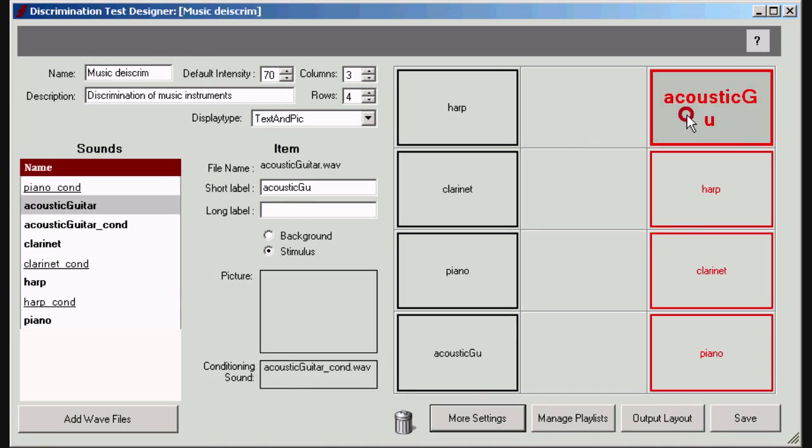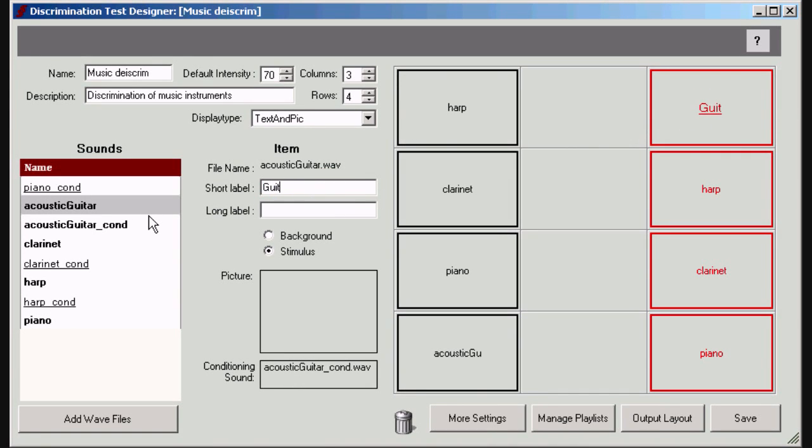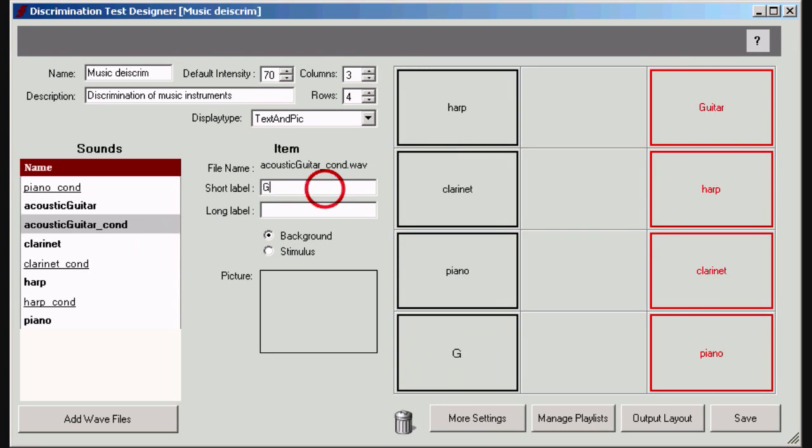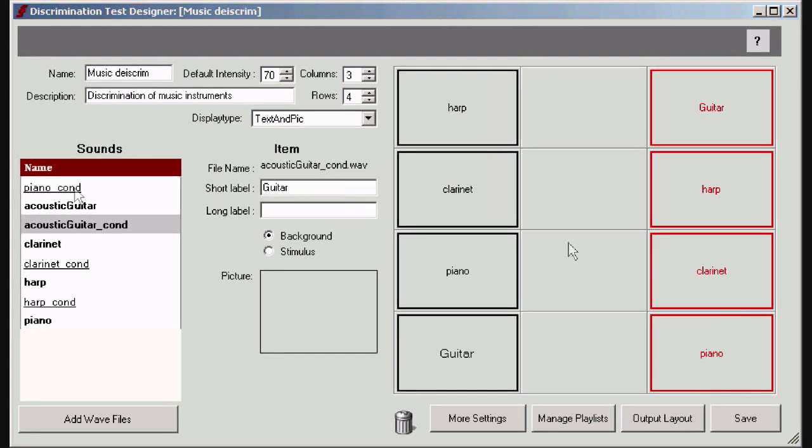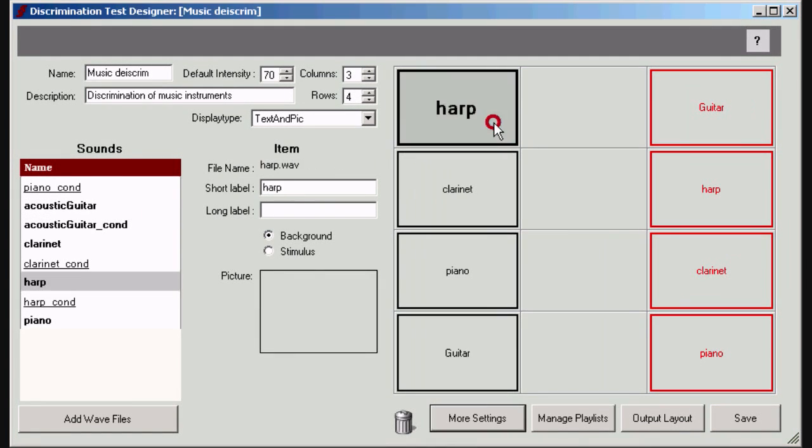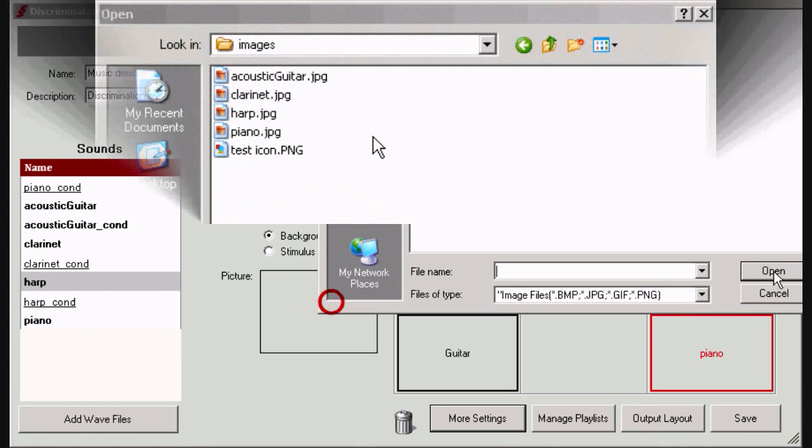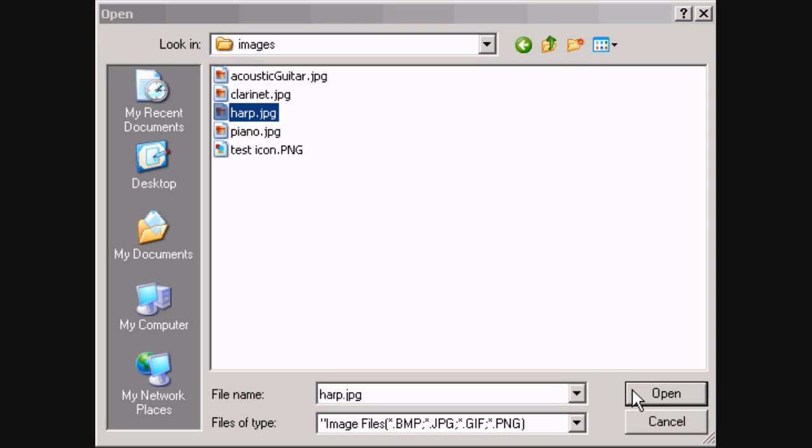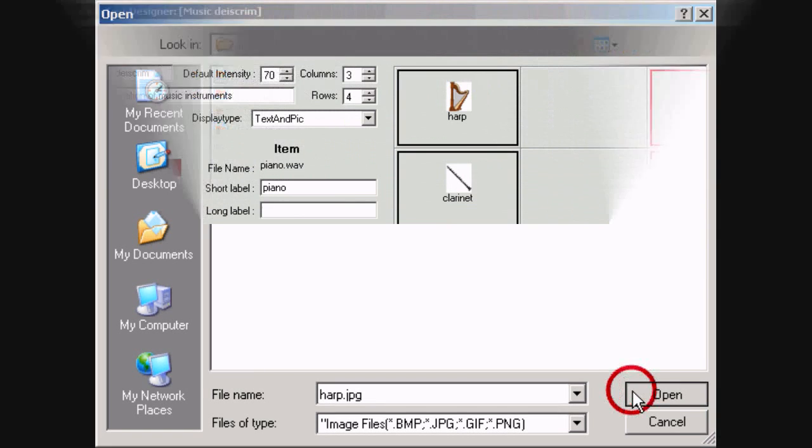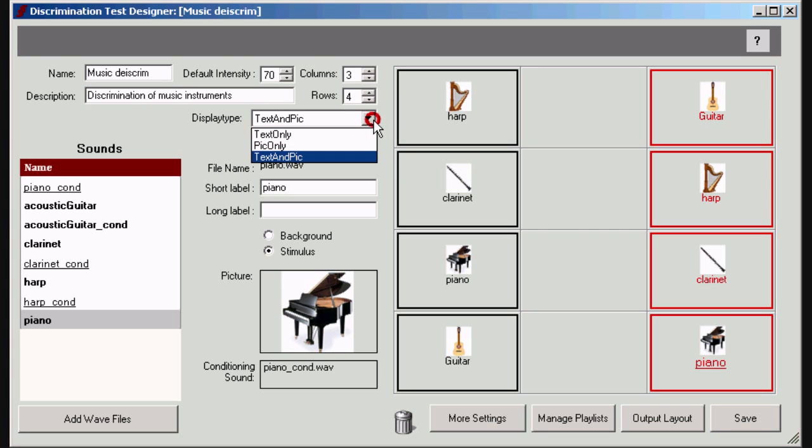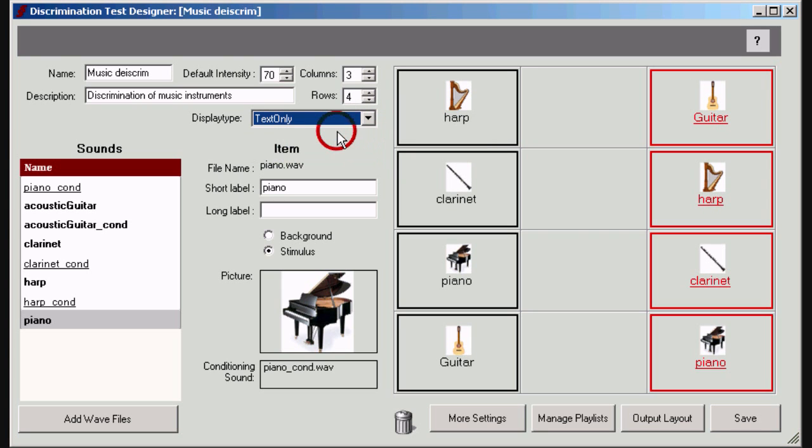You can change the label that will be displayed on the final item button. You can add a picture to represent the test item. You can choose whether the final button displays the label, the picture, or both.